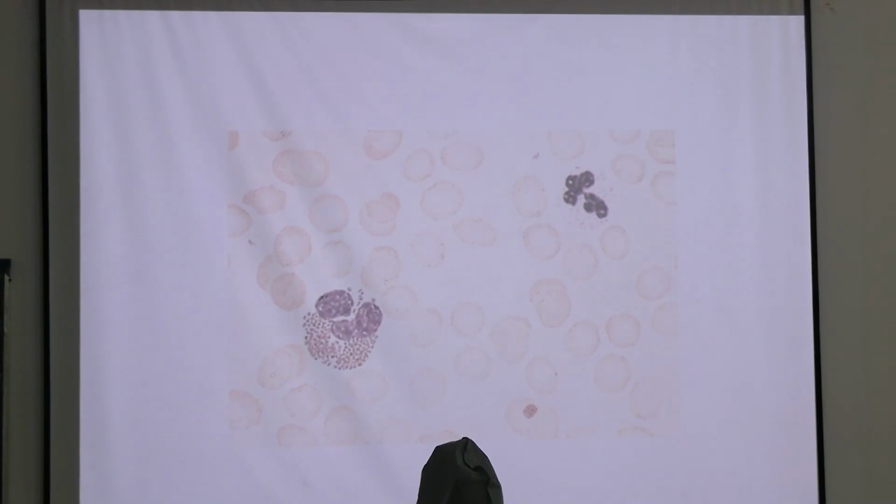Try to identify. Neutrophil. It's a neutrophil.